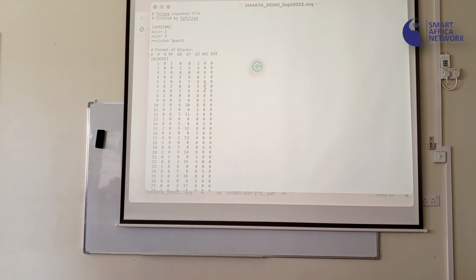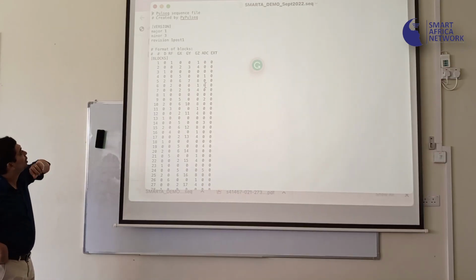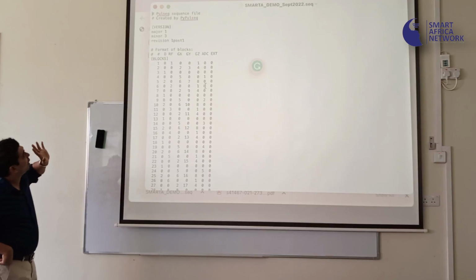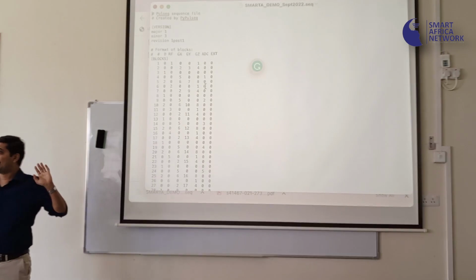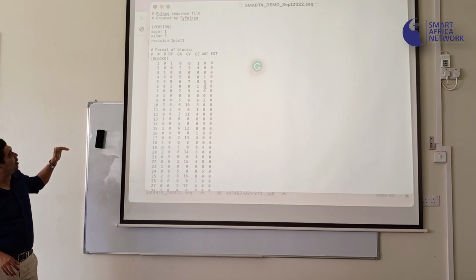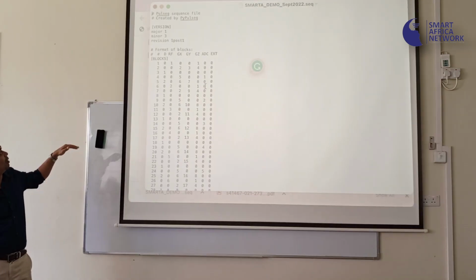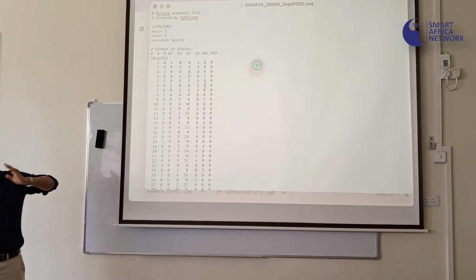So the first block has an RF and a slice-select gradient. The second block essentially has GX and GY, mostly rewinders. The third block is a delay so that you can get to the echo time that you want.